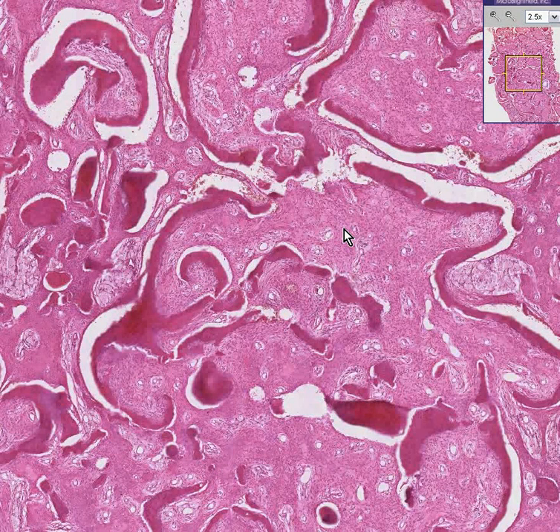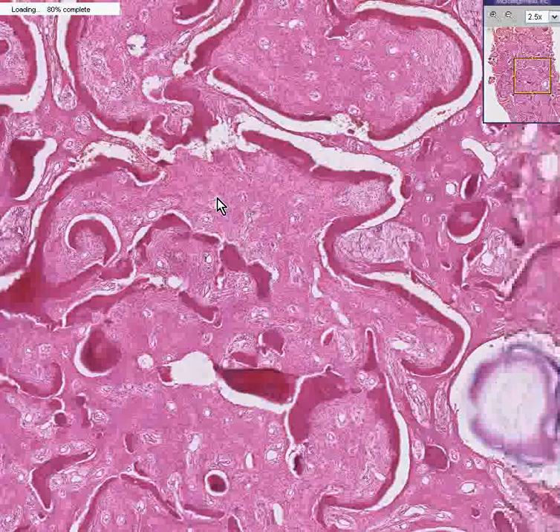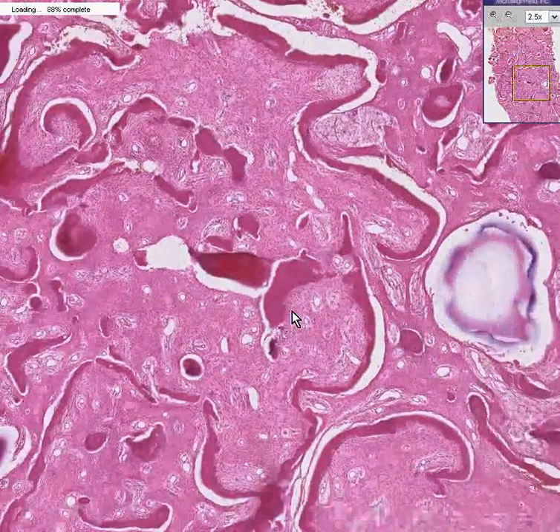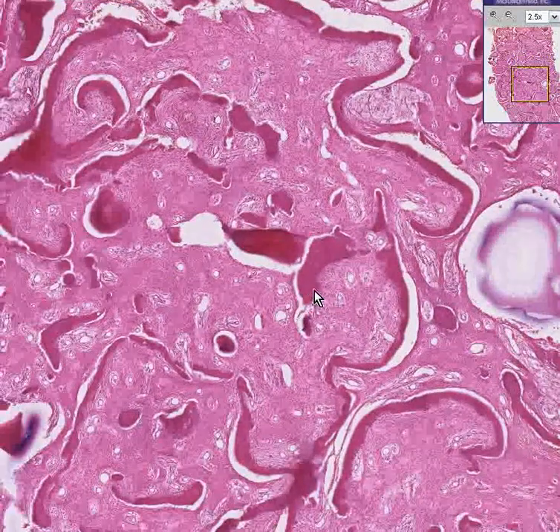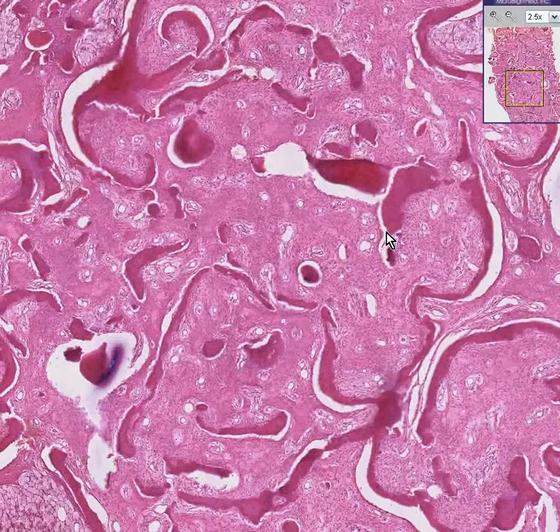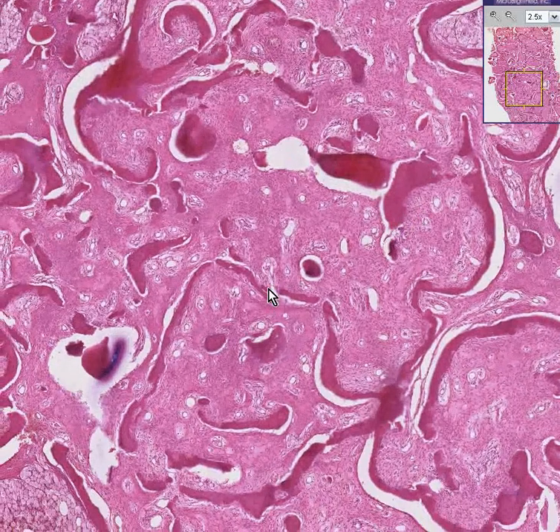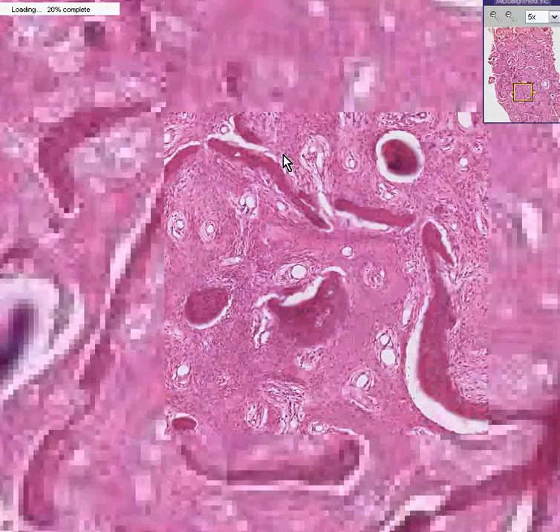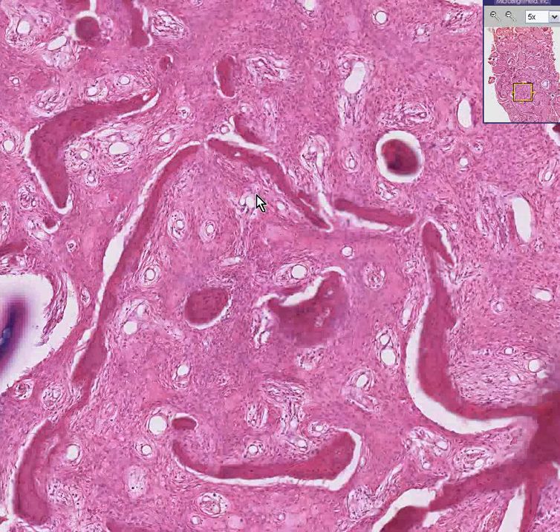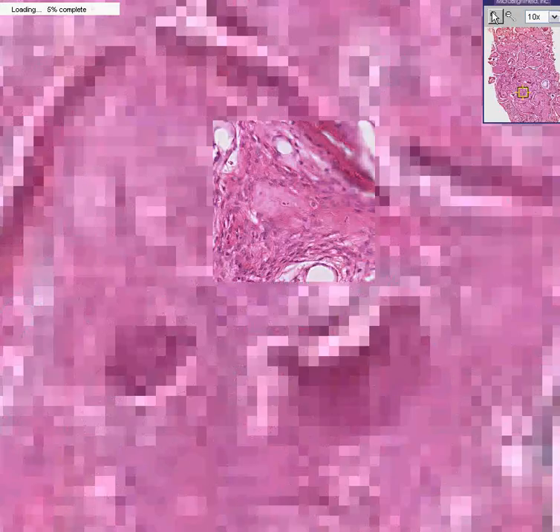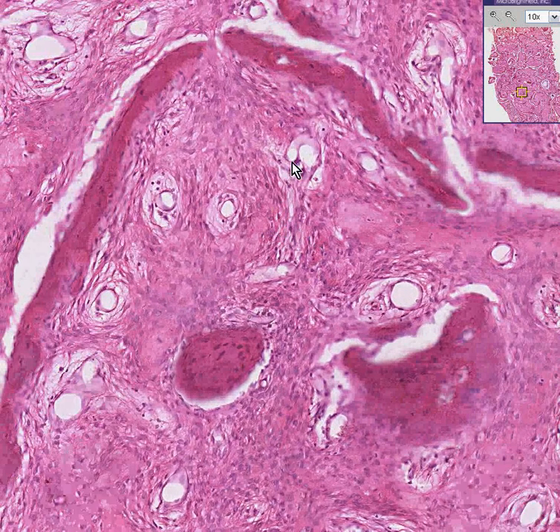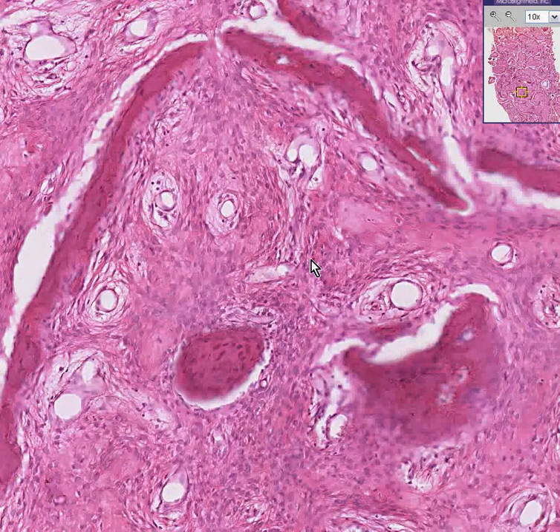This is a very classical appearance for fibrous dysplasia of bone — thinned spicules, mostly because of a tremendous overgrowth of fibrous tissue between the spicules. Here is the fibrous tissue.